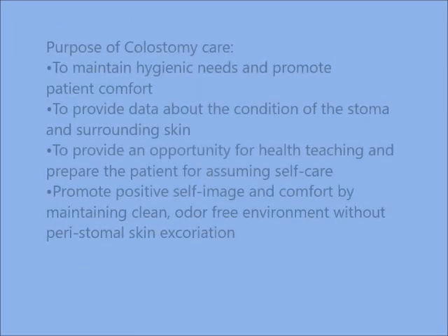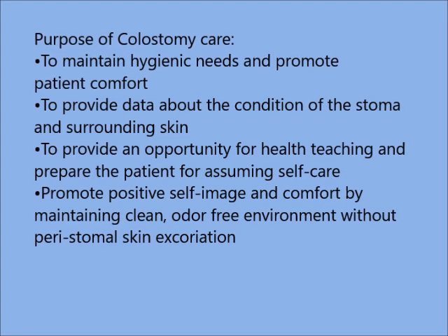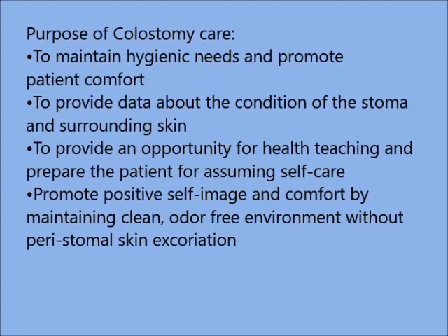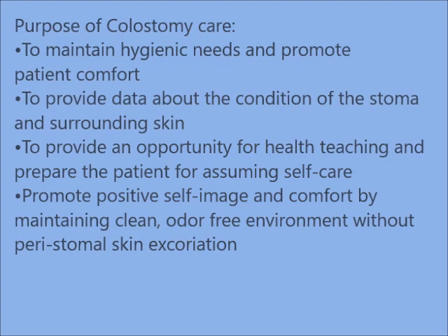The purpose of colostomy care is to maintain hygienic needs and promote patient comfort, to provide data about the condition of the stoma and surrounding skin, to provide an opportunity for health teaching and prepare the client for assuming self-care, and to promote positive self-image and comfort by maintaining a clean, odor-free environment without peristomal skin excoriation.